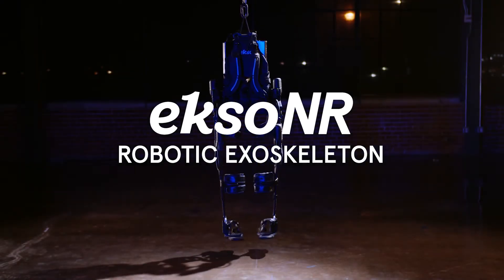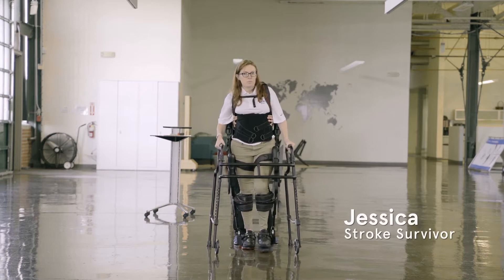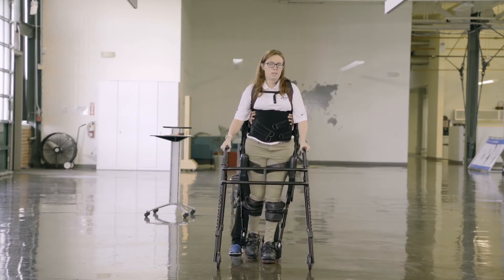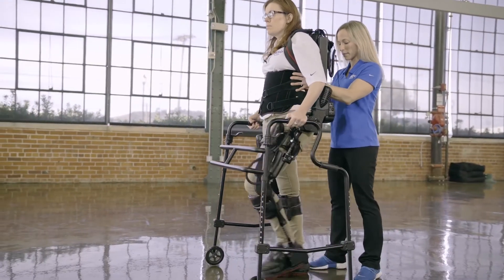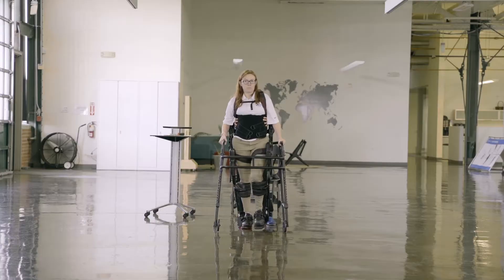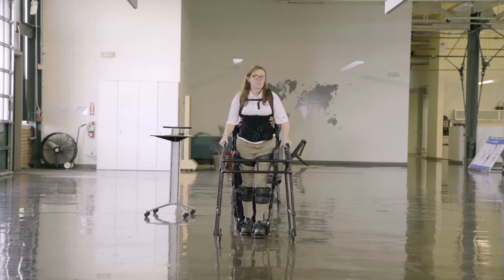XONR is a wearable robotic gait training device that can be used to address different goals for ambulation. XONR was designed to be used as a tool for physical therapists in a rehabilitation setting to address early mobility and gait retraining goals through patterning, stepping, and providing only supplemental assistance when a person needs it.